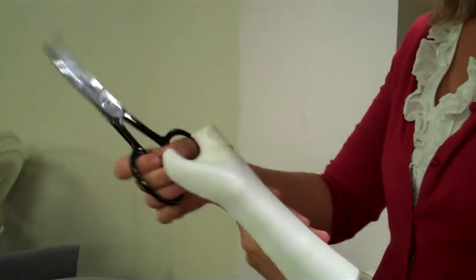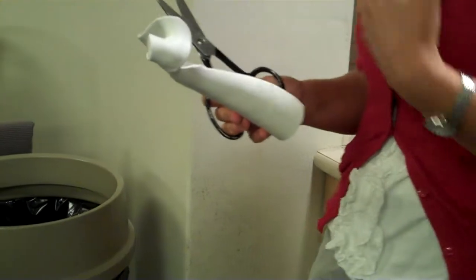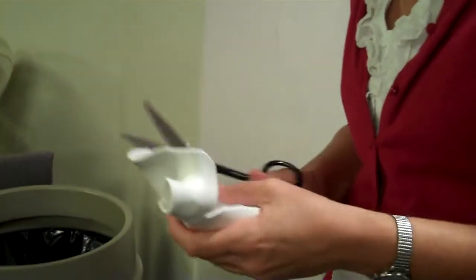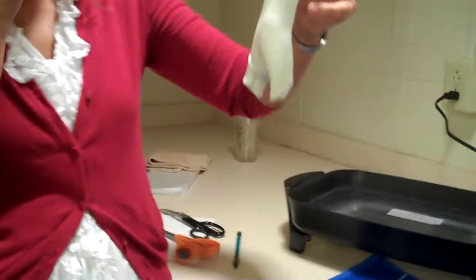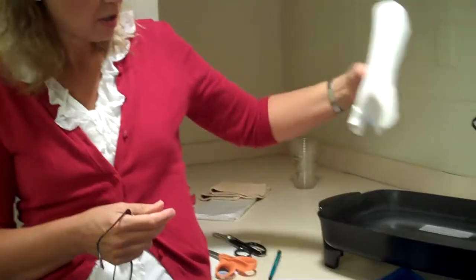And you guys said it was too long here, right? So what are the two ways that I could fix it? Roll it or roll it and cut it. Okay. So let's try rolling this guy since we've cut part of it. And when you roll it, you don't want to dip the whole thing back in, obviously, because you like the rest of it pretty much.